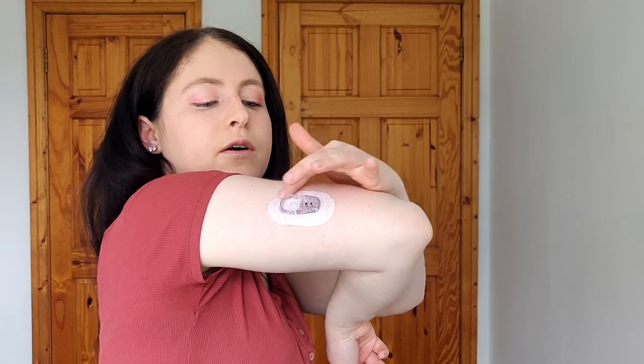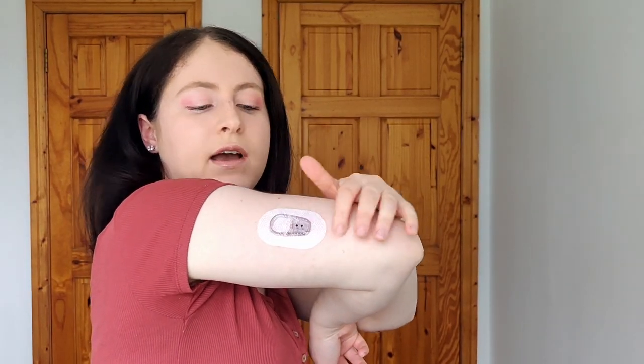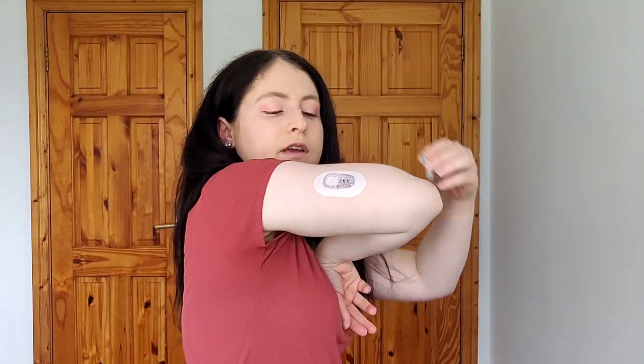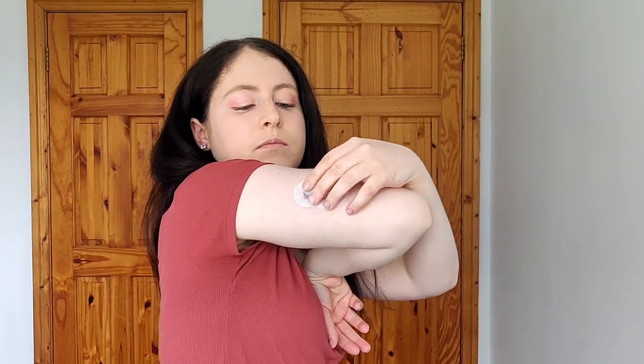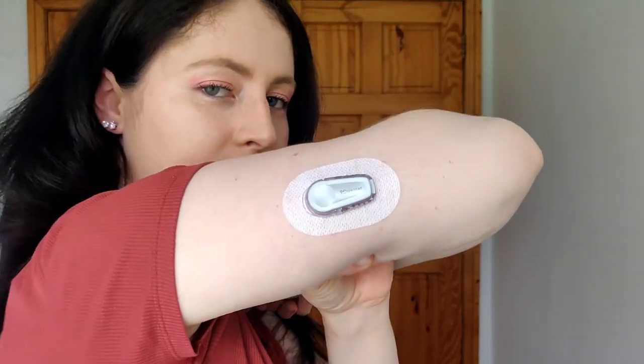We have no transmitter yet, so go over the sensor a few times to make sure it's pushed down. Sensor is ready to go. Now we attach the transmitter, which is very easy — you just get the new transmitter and push it onto the sensor until it makes a click. Once it clicks, it's secure. Now you have your sensor on and your transmitter ready to go.